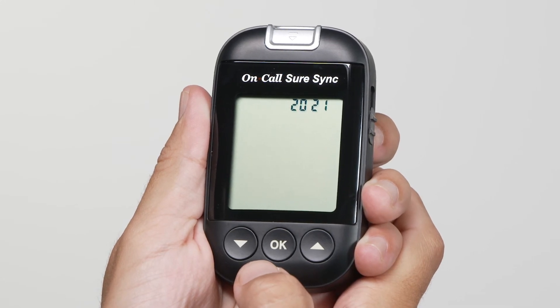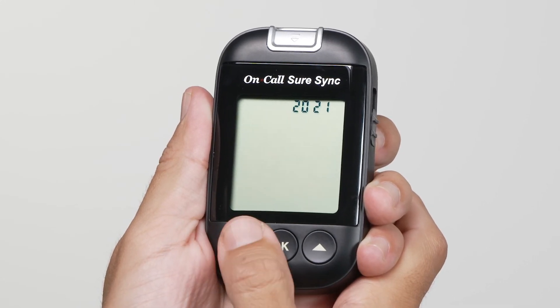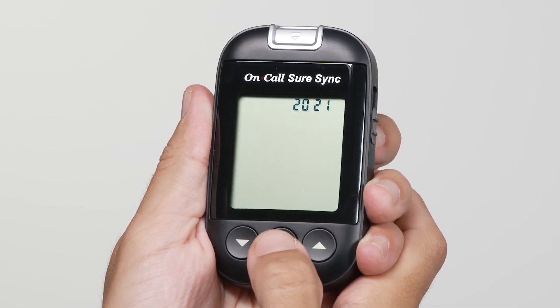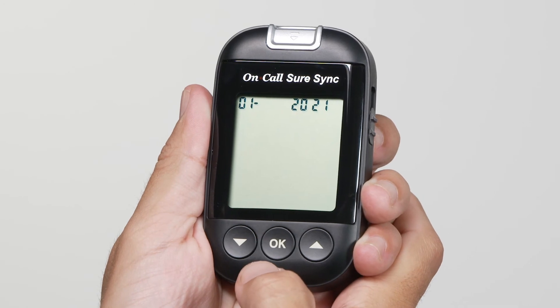The year will appear at the top of the display. Press the down or up button to increase or decrease the year. Once you have selected the correct year, press the OK button to save your choice and start setting the month.